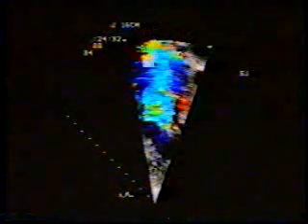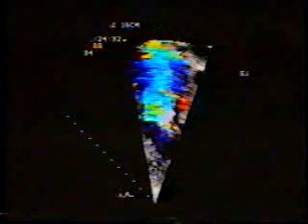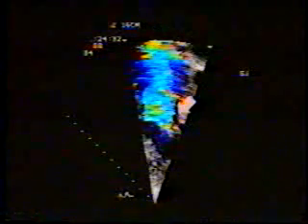Color flow examination demonstrated severe degree of tricuspid regurgitation, and this can be seen clearly in real time now.